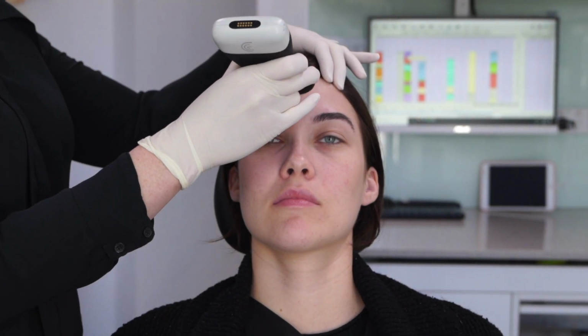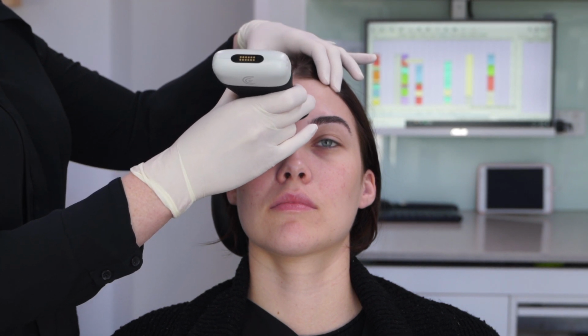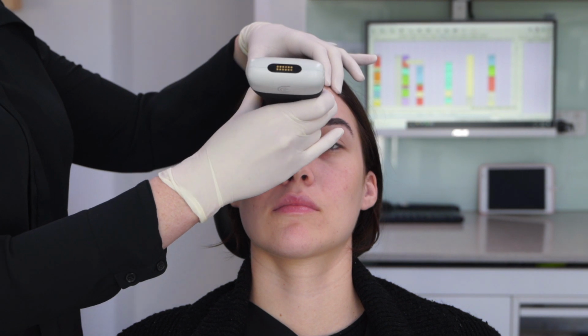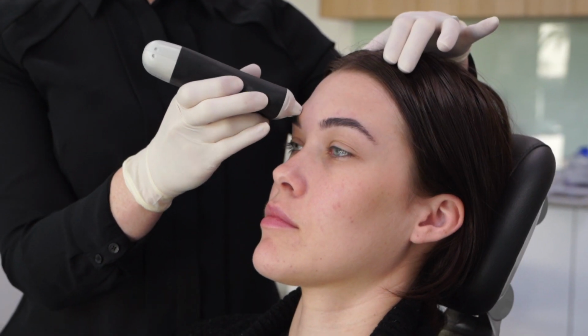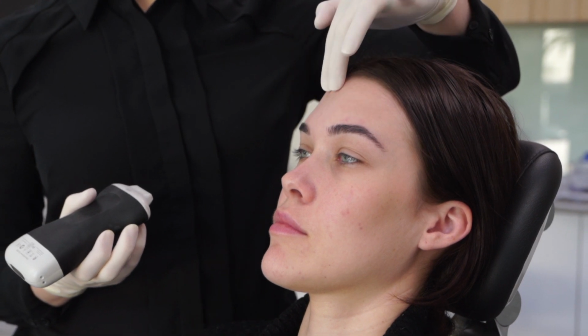The 7th position is looking at the forehead. You will place the transducer on the superior orbital rim and can slide medially and also cranially. In this area, you'll be looking for the supraorbital and supratrochlear arteries.